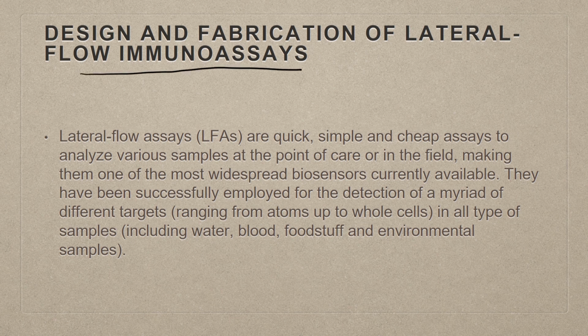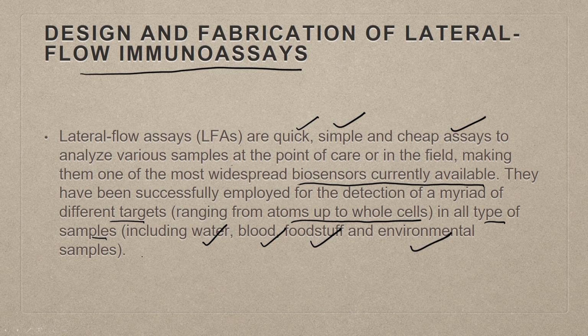So if we talk about immunoassays, LFIAs, these are quick, simple and cheap assays to analyze various samples at the point of care or in the field, making them one of the most widespread biosensors currently available. They have been successfully employed for detection of myriad of different targets ranging from atoms up to whole cells in all types of samples including water, blood, foodstuff, environmental sample, urine and other feces.